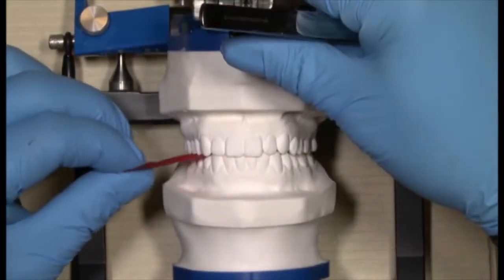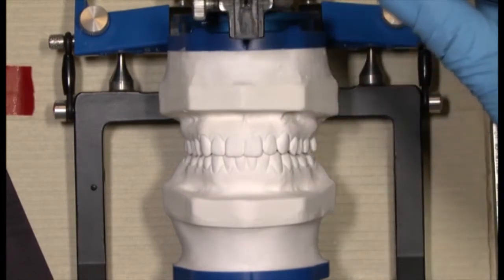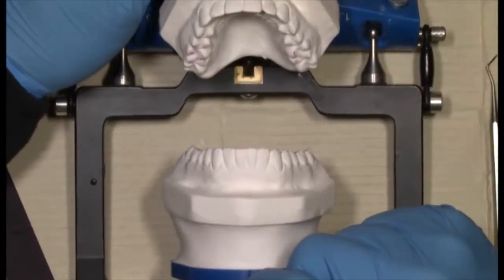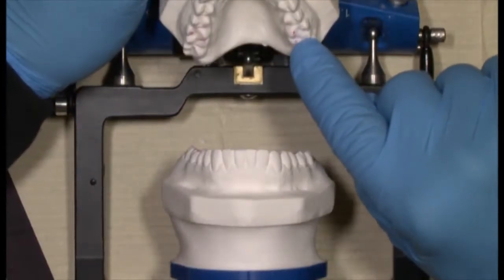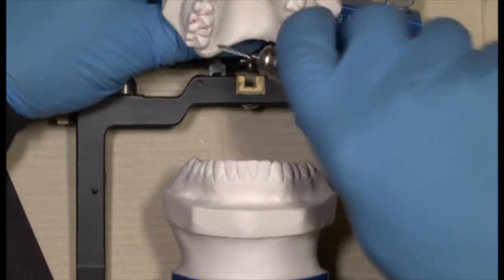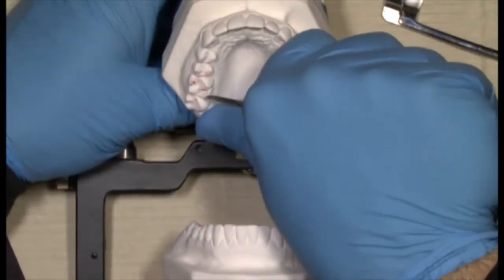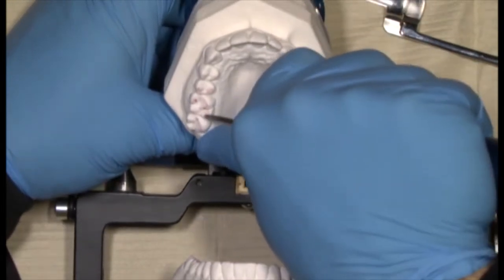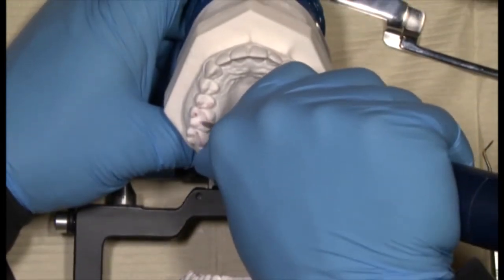This is tight on this side, but pulls here. So when I open this, you will see enough smudge marks. So these are smudges on this side because it doesn't really touch. But in the meantime, we want to deepen the fossa and take it off the incline. Now this is on an incline, so this will go away.